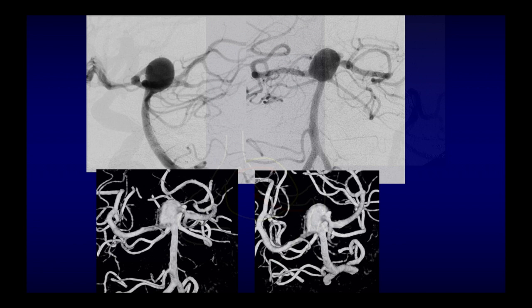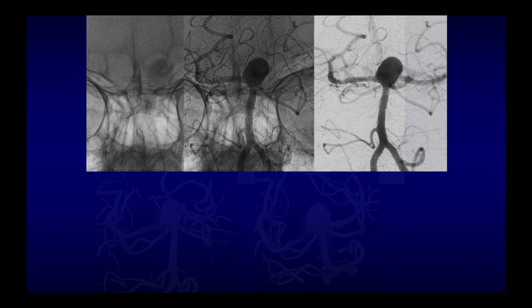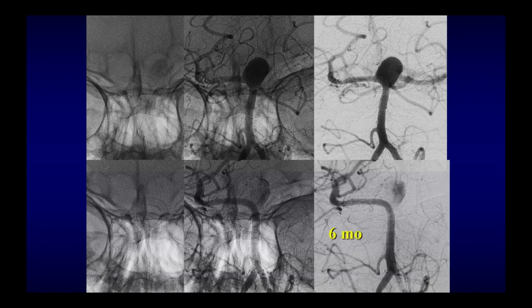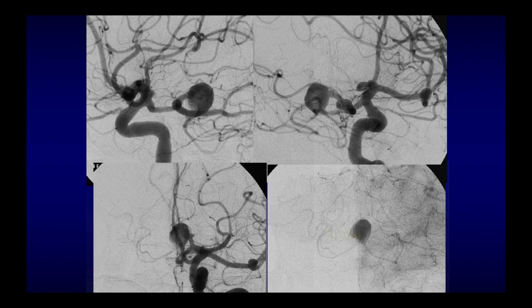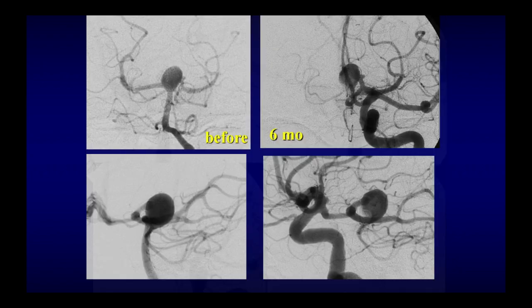And this is another example, of a kind of different, but always due to the presence of communicating arteries. So it's a basilar tip aneurysm. And we said, well, wonderful, we place the flow diverters like this, P1 to the basilar, and we will have a perfect result. The 6 months follow-up doesn't really show a shrinking of the aneurysm. On the contrary, if you look at the posterior communicating artery, now the aneurysm is still there, very well filled.